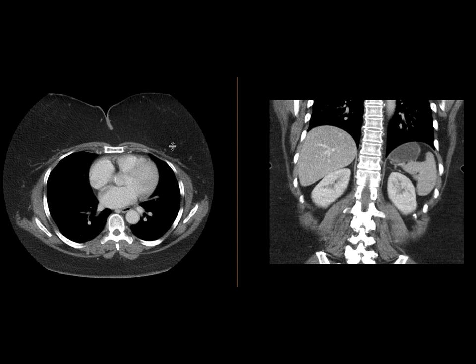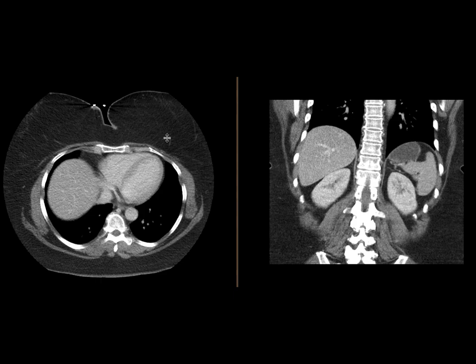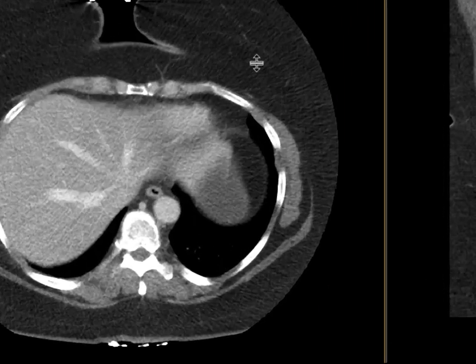This is a patient who comes in with some nonspecific abdominal pain, and a CT scan of the abdomen is performed with intravenous contrast.